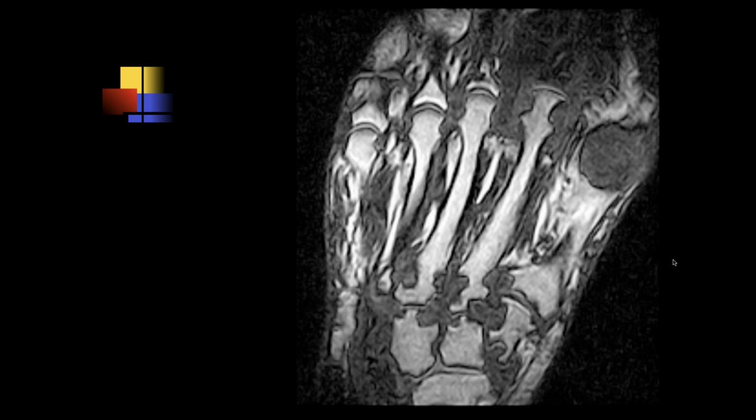Looks like a lot of erosions at the tarsometatarsal joints, as well as at the first distal metatarsal. Bone erosions.